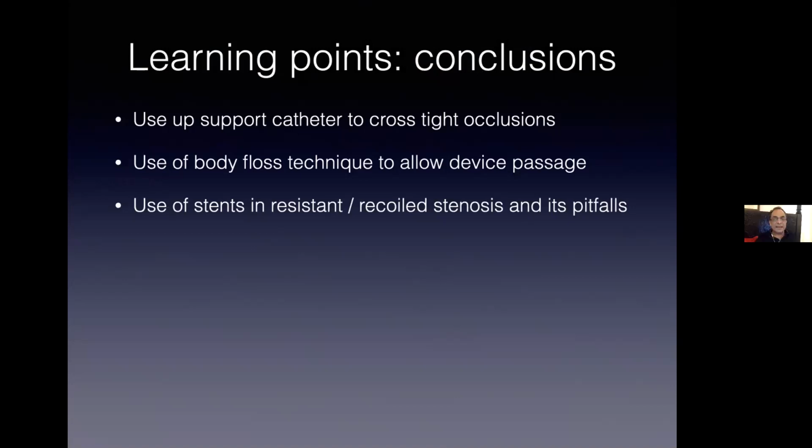I've realized that in the cases where we used stents, we would actually have been better off doing the surgical rib resection and a repeat angioplasty. This is a personal opinion. I know that the literature is replete with covered stents and Viabahn and things like that. I know that Viru uses more stents than we do, and people's opinions will vary, but it's my own personal opinion that the bony thorax is very, very important. Actually the stent, probably because of the bigger framework, is able to push for a bit longer perhaps.